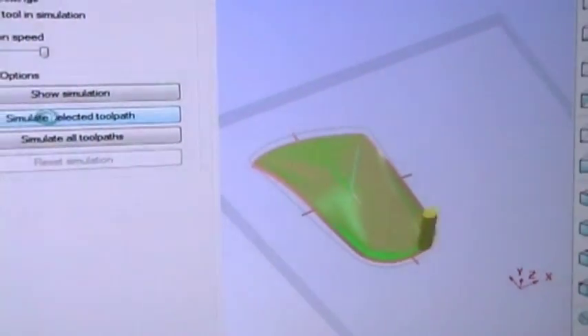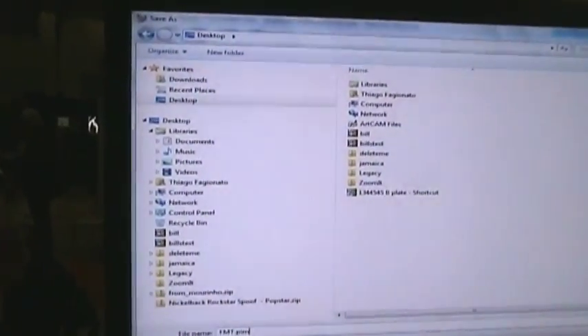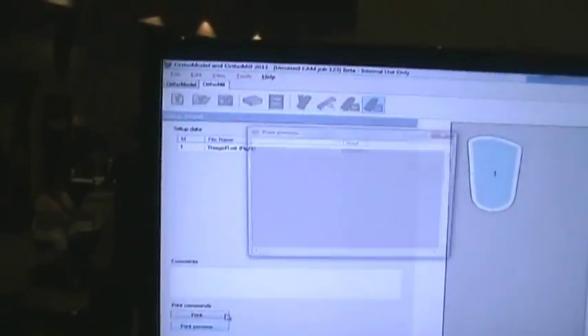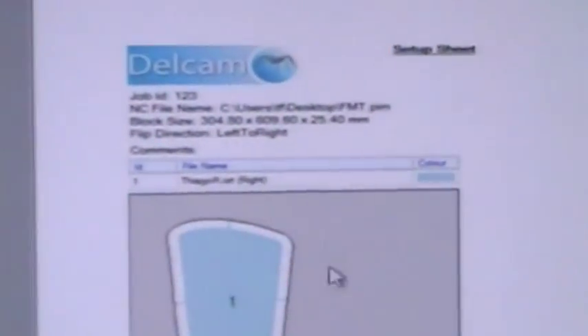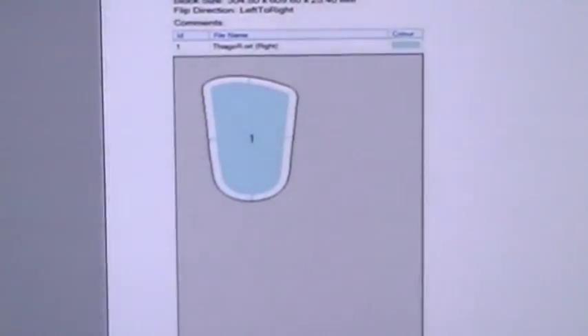OrthoModel will tell you before you run the toolpath on the machine how long it's going to take and how the tool is going to cut the orthotic. Once finished, all we have to do is convert everything into G-code. OrthoMil writes the G-code to the FMT machine and creates a setup sheet that can be printed for the operators running the machine, including the job ID, file save location, block sizes, and patients inside the block. The setup sheet can be printed to track production when machining the orthotics.